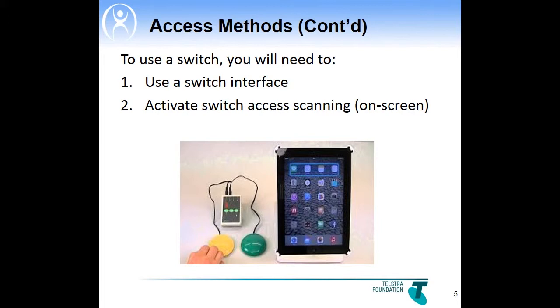2. Switch access scanning is an indirect selection technique or access method used by an assistive technology user, including those who use AAC to choose items from the selection set. Unlike direct selection, such as typing on a keyboard or touching a screen, a scanner can only make selections when the scanning indicator or cursor of the electronic device is on the desired choice.